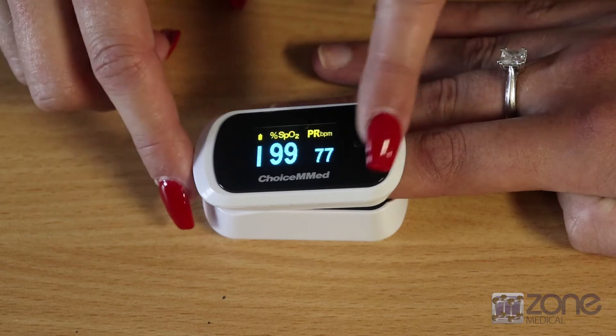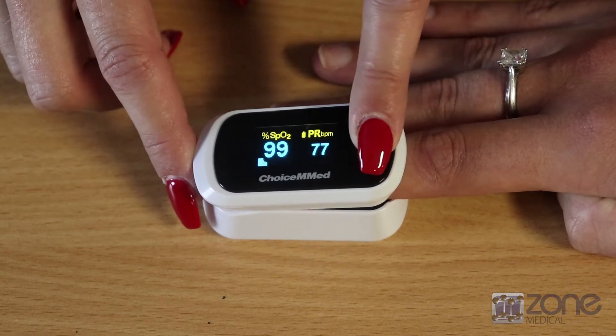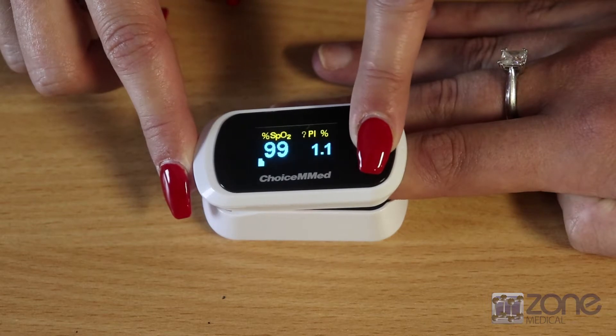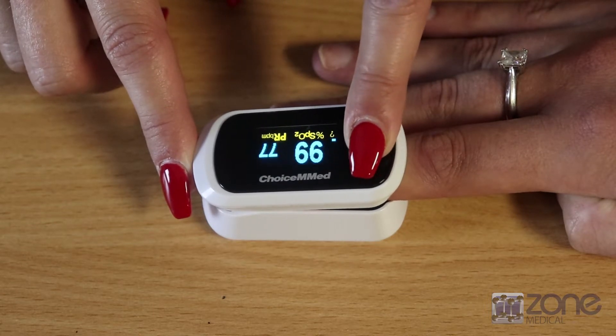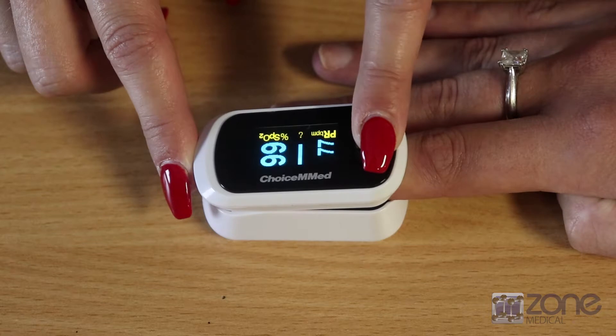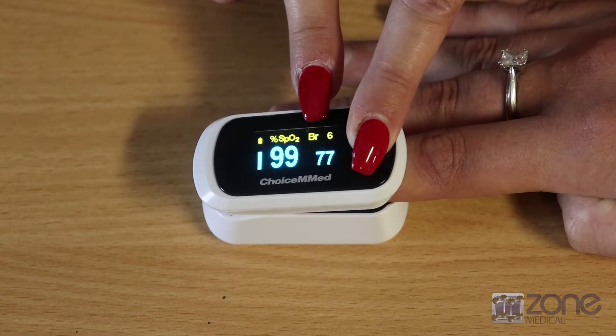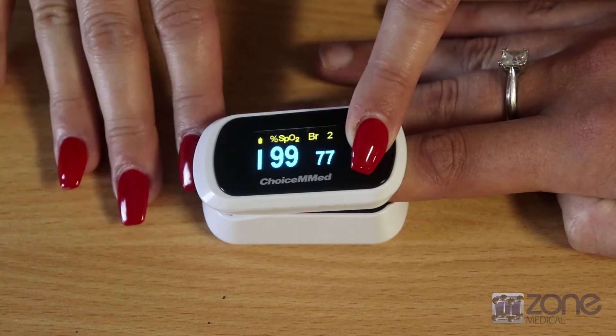You can also change the display by pressing the power button. This will allow the PLETH to show, or you can rotate the screen and change the numeric display. Pressing and holding will increase the brightness, of which there are 10 levels. This can also serve to increase the battery life.